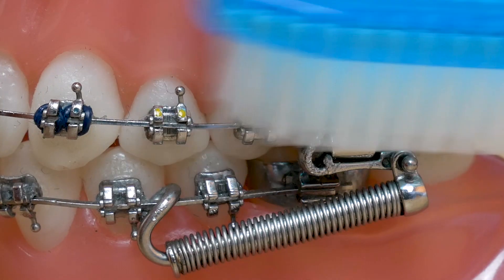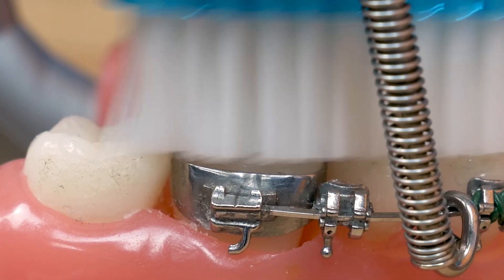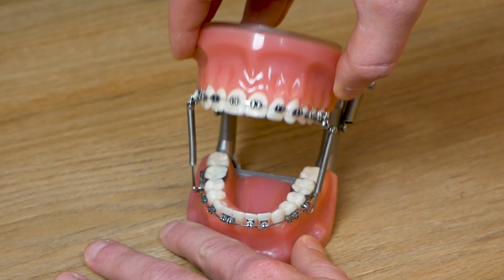It is still important for you to take care of your forces by brushing the coil and other metal pieces of the appliance. It is also a good idea not to open your mouth too wide in order to limit the chances of your forces coming apart.